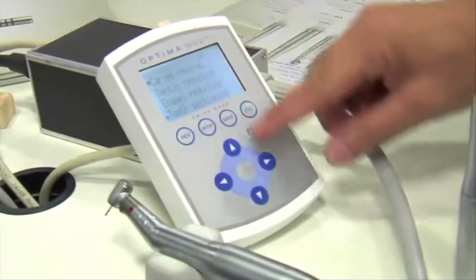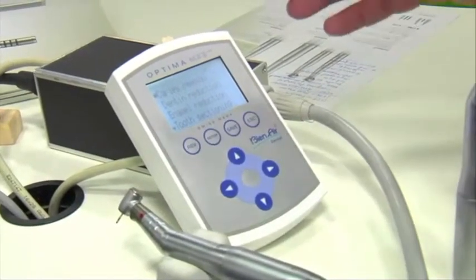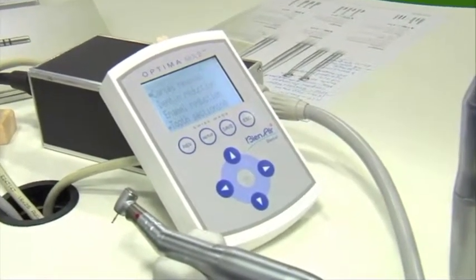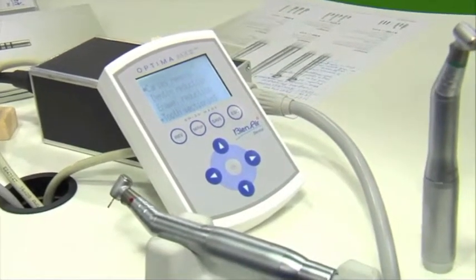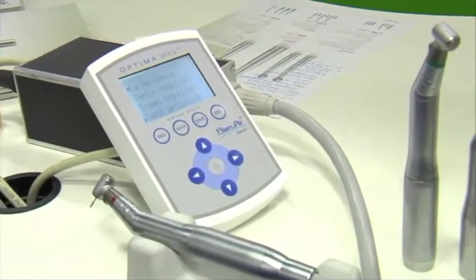All of these different procedures are pre-programmed in our display, which includes everything from caries to dentin to enamel reduction to tooth sectioning. It's a very simple one-touch display — you can get from one position to the next with simply one touch.